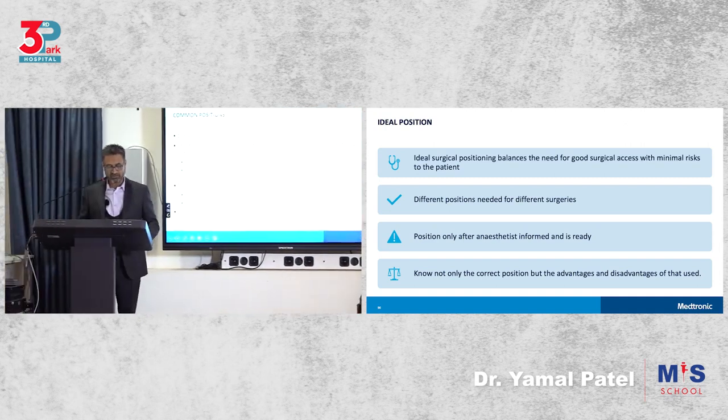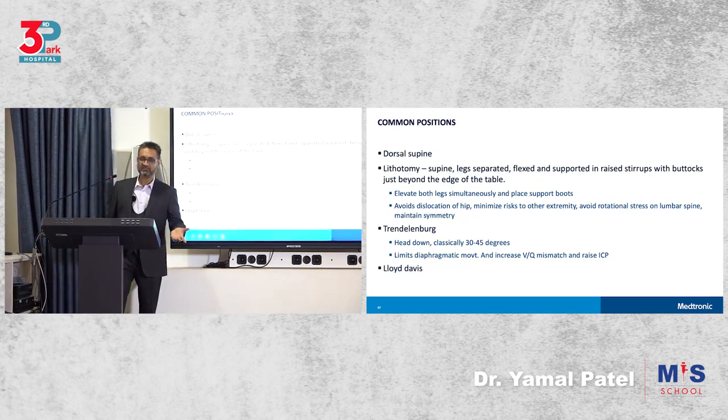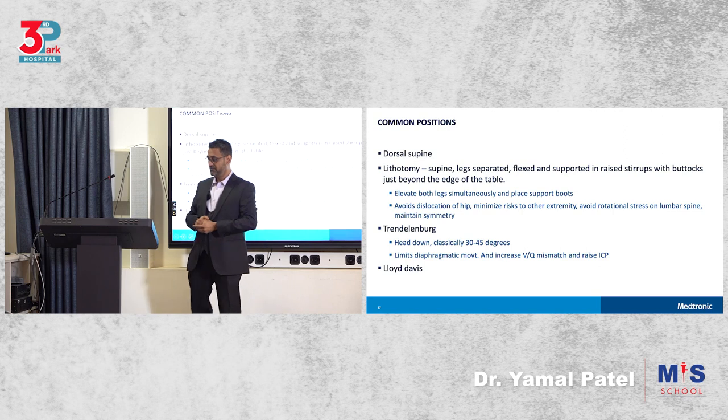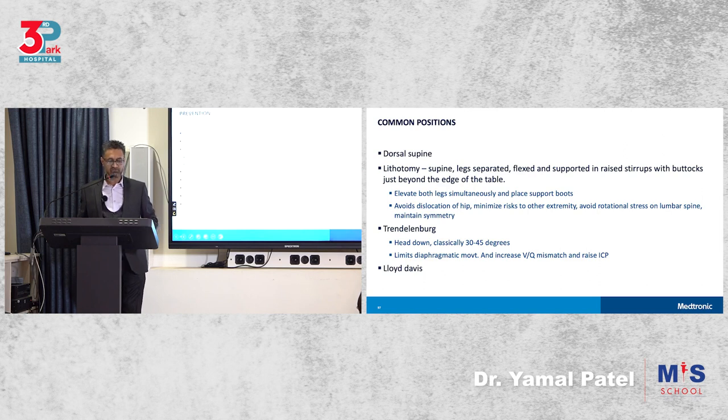So you should know the correct position. Now, what are the common positions we use in gynae? We have a dorsal supine position. We have a lithotomy position. We have a semi-lithotomy position, which is the Lloyd-Davis position. And then we have a Trendelenburg position, where we have a head-down position that we would use.